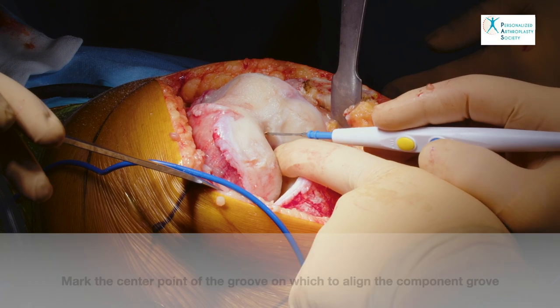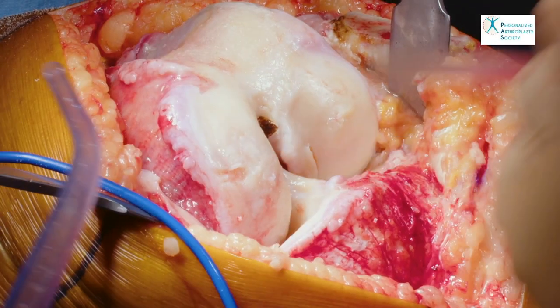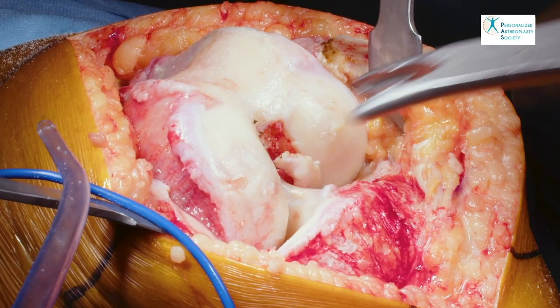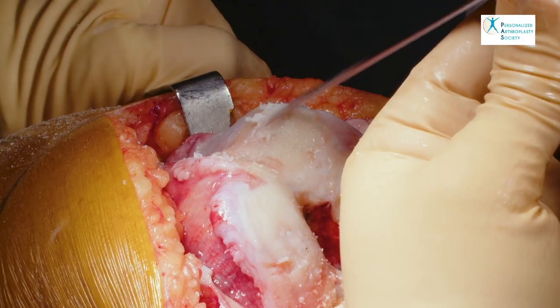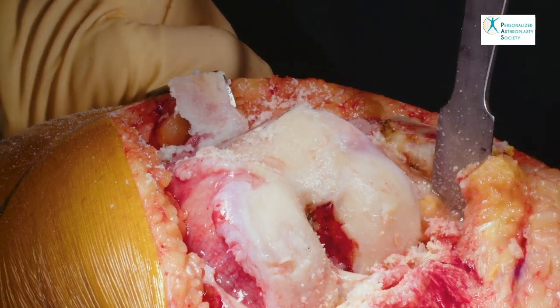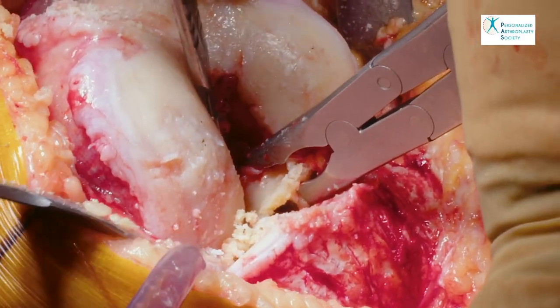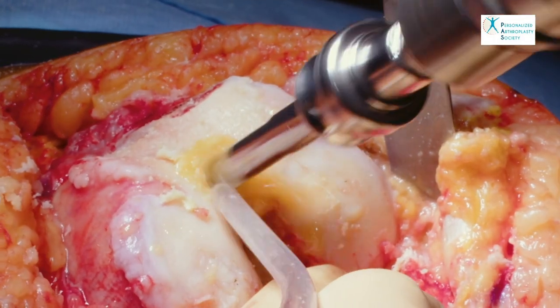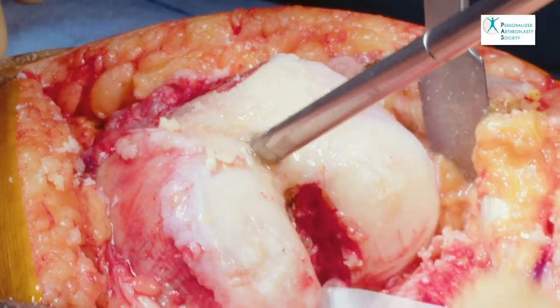The center point of the groove is marked. Notch osteophytes are removed. The center point is reassessed. It will be co-aligned with the prosthetic groove center point to determine the medial-lateral translation of the prosthesis. The tibial spines are osteotomized and the anterior lateral condyle ridge is removed to facilitate AP sizing. The femoral canal is broached and the intramedullary guide is inserted. This is only used to determine the sagittal plane flexion of the femoral component, not the varus valgus.